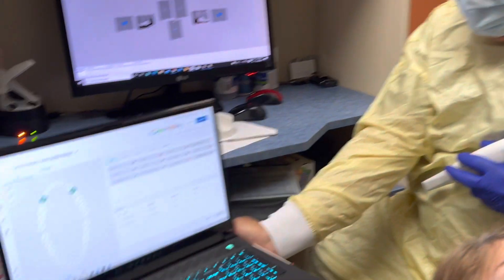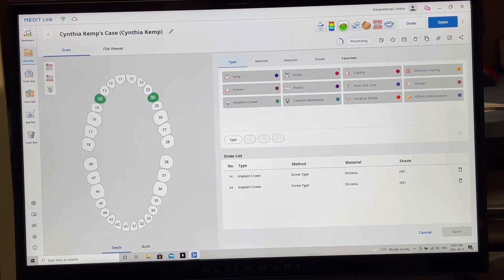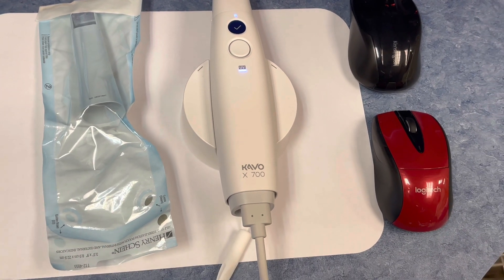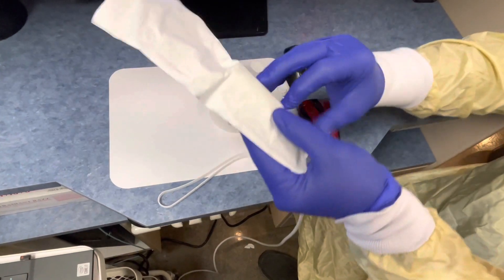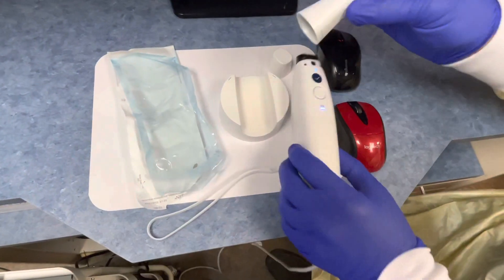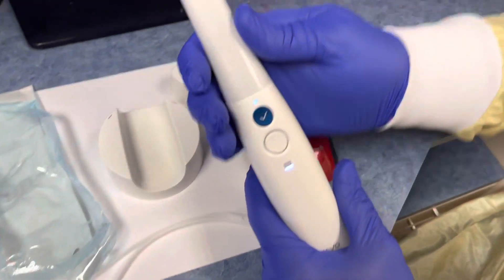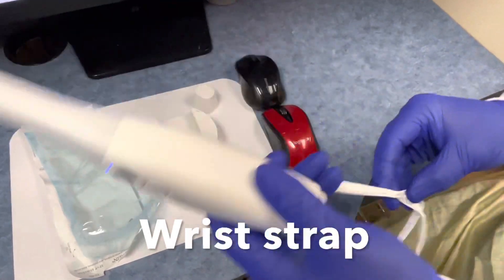My team has already done about six scans with this scanner this afternoon. We're going to do a scan on my Dell laptop — a super high-end computer. We're going to do two pre-molars using the On1 system. The scanner is all ready to go — it's been wiped down and it's in the cradle. We've got a red mouse for the scanner itself and the black mouse is for my DTX software. You can also quickly take everything to the consult room. I'll pull the tip from the top to protect the end — this end can go both ways, so you can use it for upper or lower arch depending on how your thumb hits the check mark button, which starts and stops the scanner.